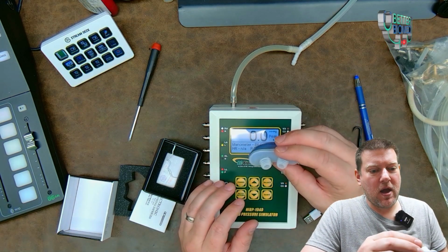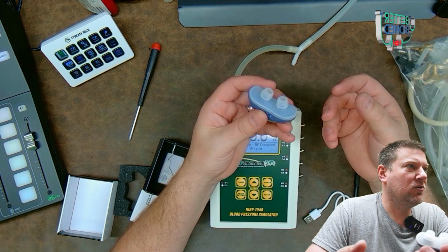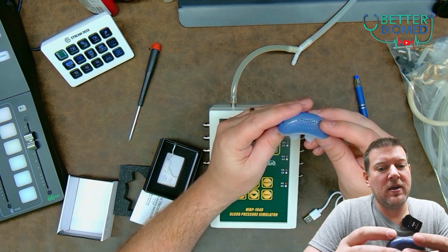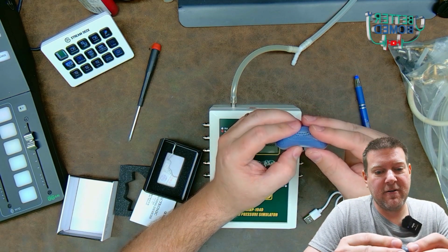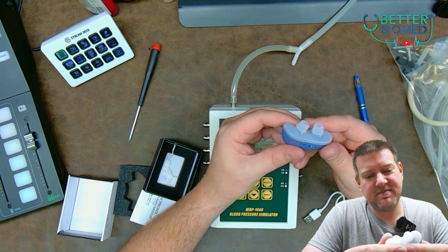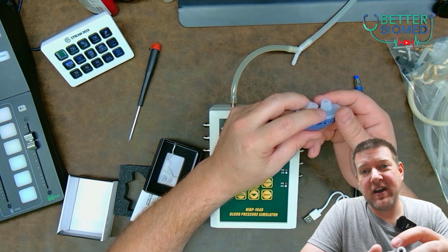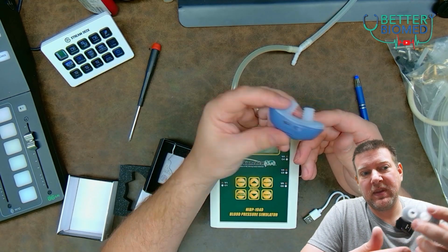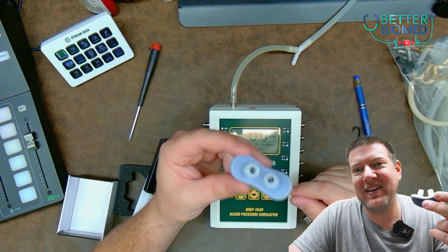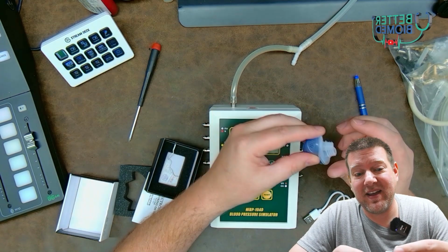Right now, what I do see is you are taking a wide open manifold, which is your nose, and you are obstructing it by making it go through this little device right here. Now, there's another thing to be wary of, and that is that this guy clearly has some sort of lithium cell battery inside it. We're gonna open it up and find out, but a lithium battery has the ability to emit deadly fumes, and you literally have this thing plugged into your nose. So you are breathing in whatever this thing is going to give off. That's how wild it is.